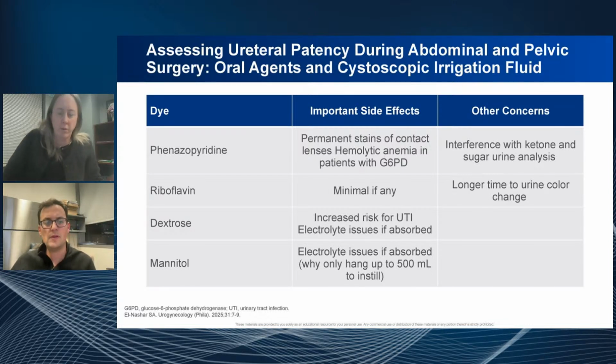Yeah, I think it's important to really be aware: if you end up doing a cystoscopy and there's a bladder injury, then you really have to stop putting in the dextrose and mannitol, because you're putting a hypertonic solution into the bladder and you have to start draining it. If the bladder's intact, it's probably not as much of a concern that it's being absorbed, because after the cysto, you just drain it. But that's a really good point.